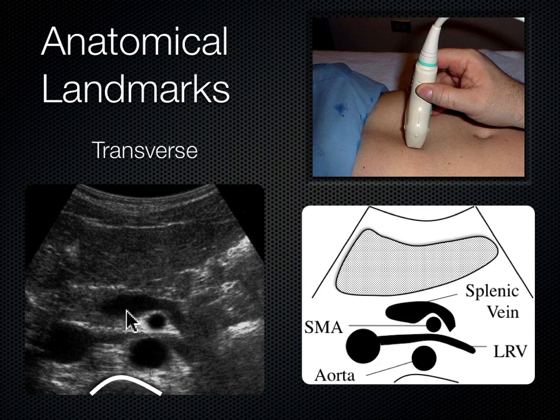So that's where that splenic vein is going to become the portal vein, eventually when it meets up with the superior mesenteric vein. Again, I realize you haven't had that anatomy yet, but you're going to start to see all these things on ultrasound really soon, so I think I should point them out. Outside that splenic vein, that's the pancreas over here, and then above here, this is all the liver. So I'll trace the margin of the liver as it comes around here, and then boom, there's the pancreas there.